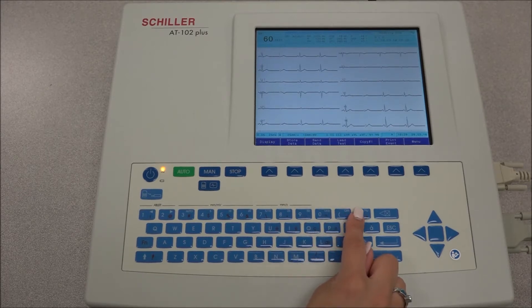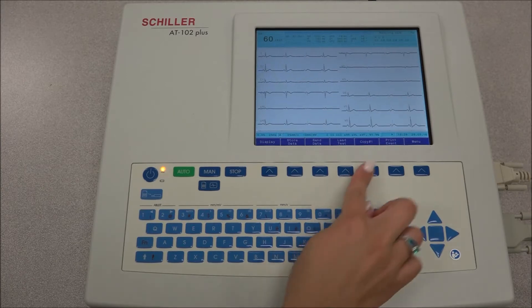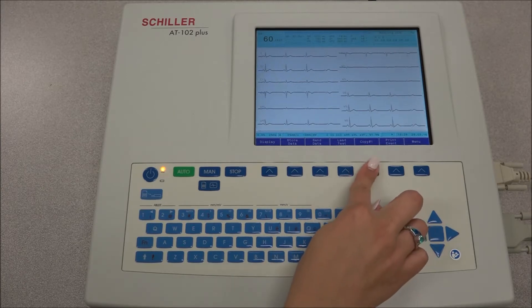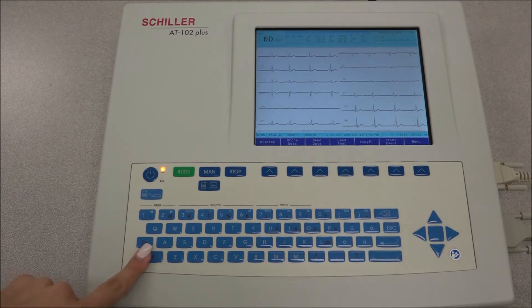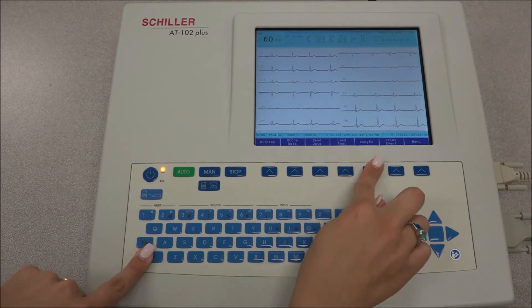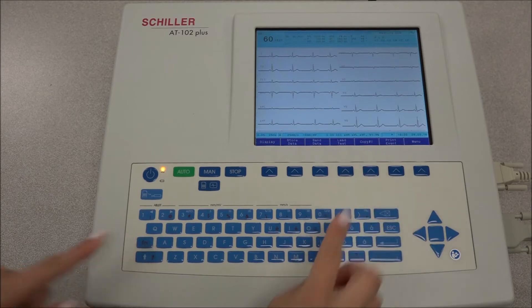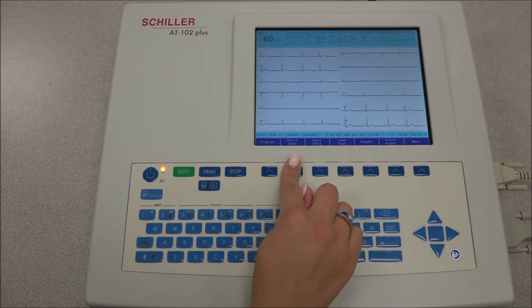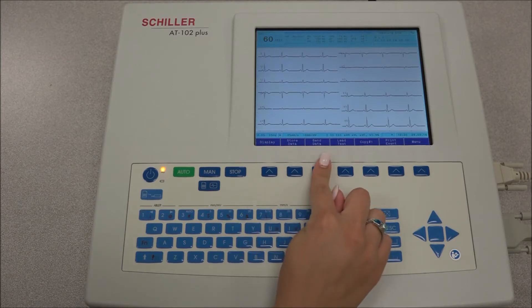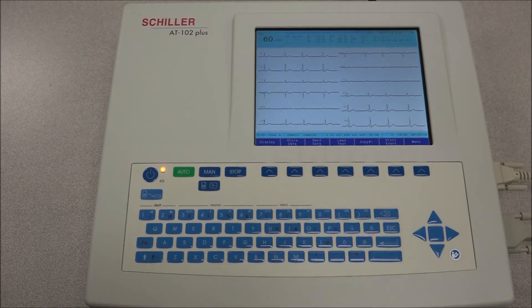To obtain a copy of the recording in format 1, press the copy 1 key. To obtain a copy in format 2, press the CAPS key and the copy 1 key will change to copy 2. To store the recording manually, press the STORE DATA key, and to transmit the recording manually, press the SEND DATA key.